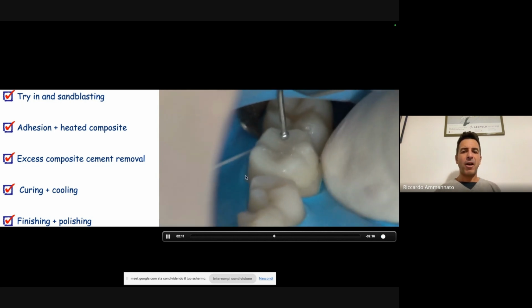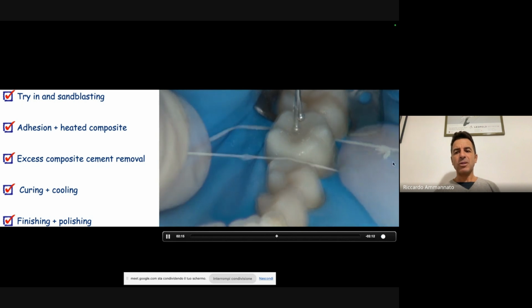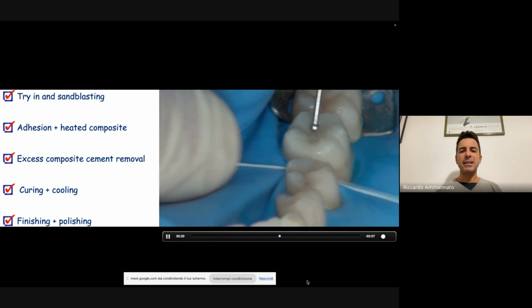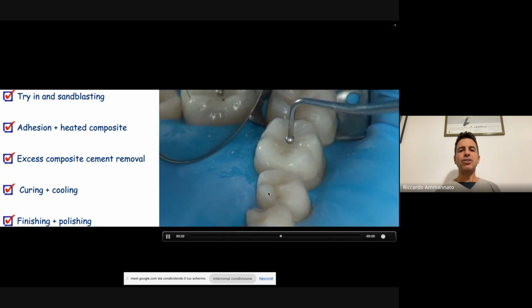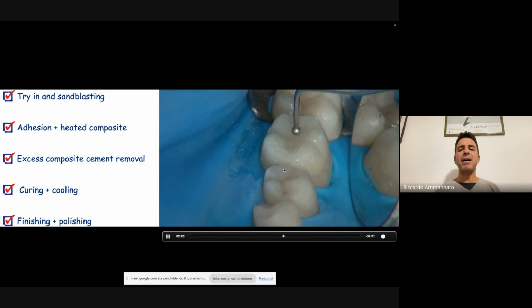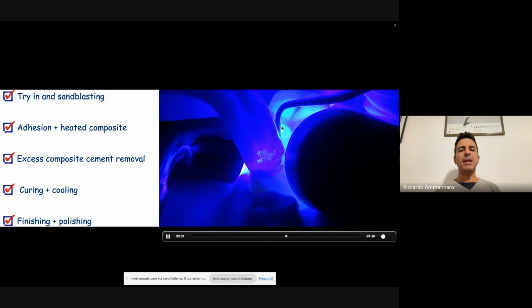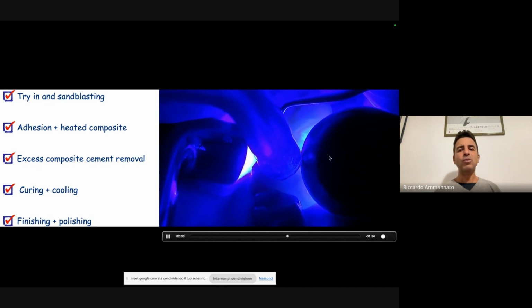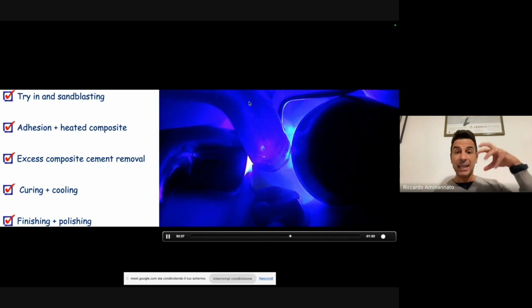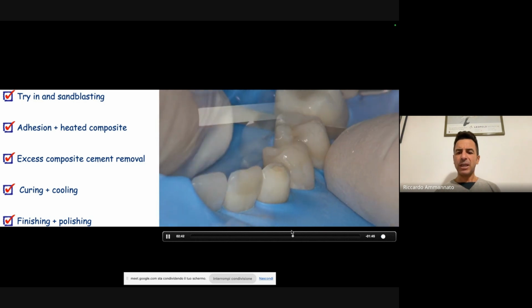I go with my floss, that has a knot, in order to remove some interproximal composite. You see that it's coming out on the distal, and on the mesial side, the same situation, checking 360 degrees if everything is clean, if I have other excess material to remove. And then the assistant keeps the restoration down, and I'm curing with 2 curing lights for 3 minutes, using the suction as a cooler. Then I will do the finishing procedure here with the strips.